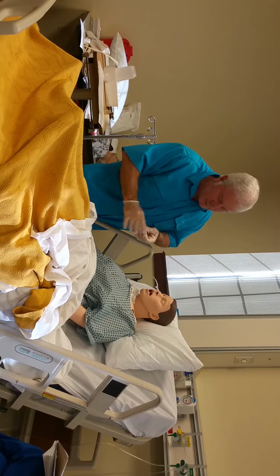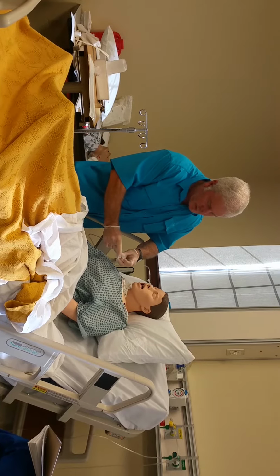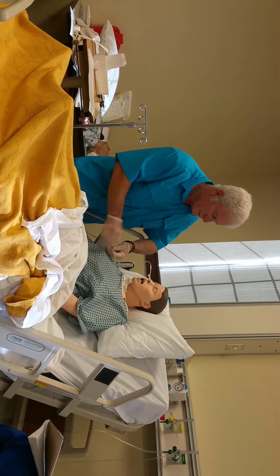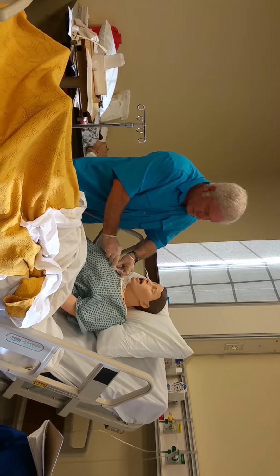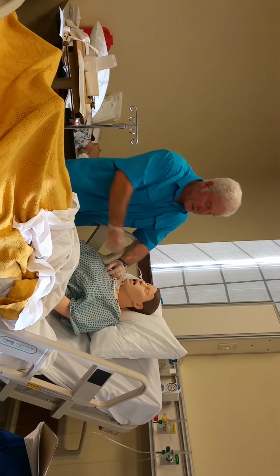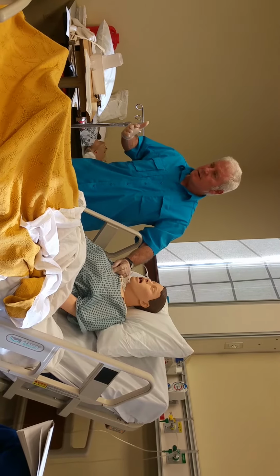And I'm going to have a safety pin with me, which we don't have any safety pins here. I'm just going to put it where I can kind of make a flag and there's a little slack in it so he can turn his head, all that sort of stuff. Try to make it comfortable, and I'm just going to tape it right there to his nose. I'm going to pin it right there to his gown. Okay? And you're done. That's putting an NG tube in.